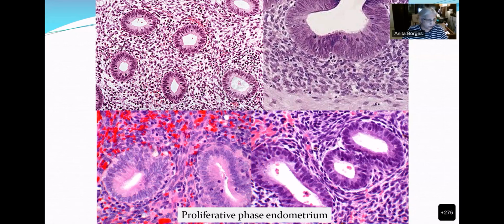And I just want to ask each of you, how often have you looked for mitosis in an endometrium? Be honest. So, ma'am, to categorize the phase of this endometrium, we look for all these features like nuclear stratification, mitosis, these well-spaced tubular glands, stromal mitosis. So then you are one of the very few people who do it. But I recommend that you do it.